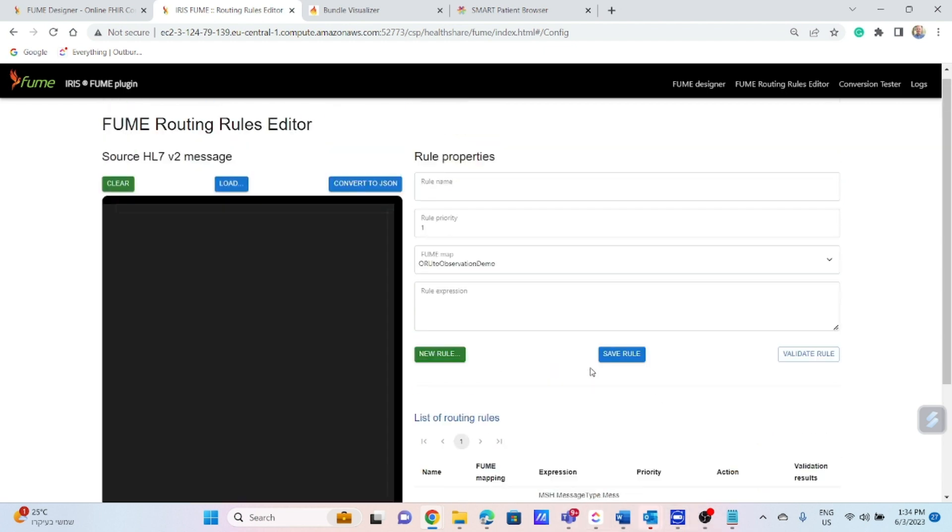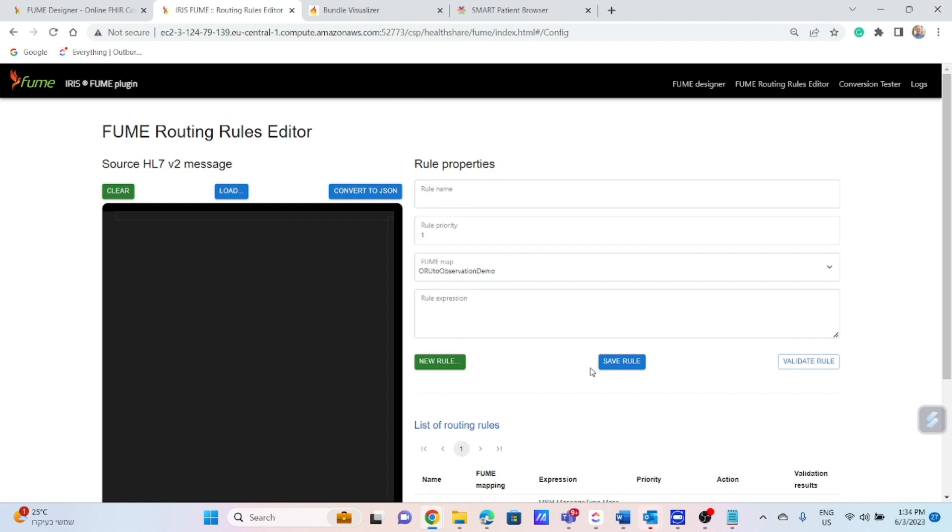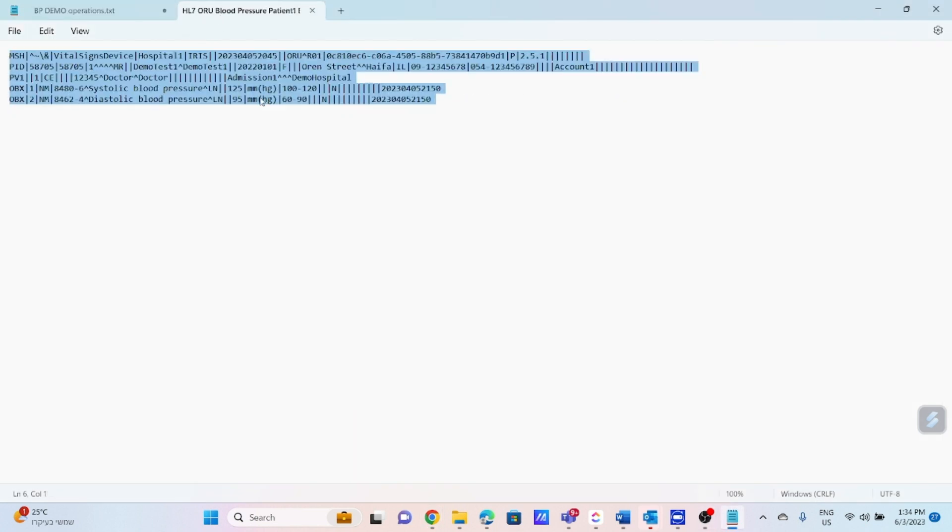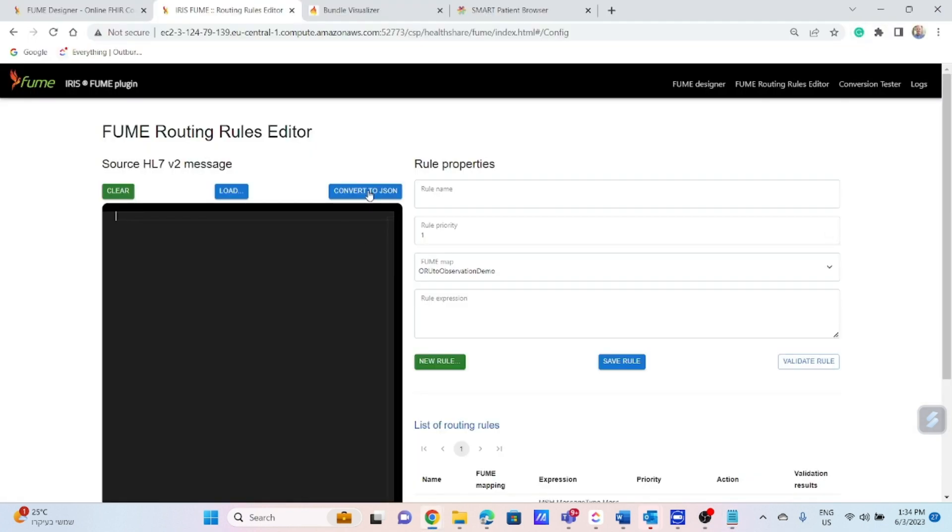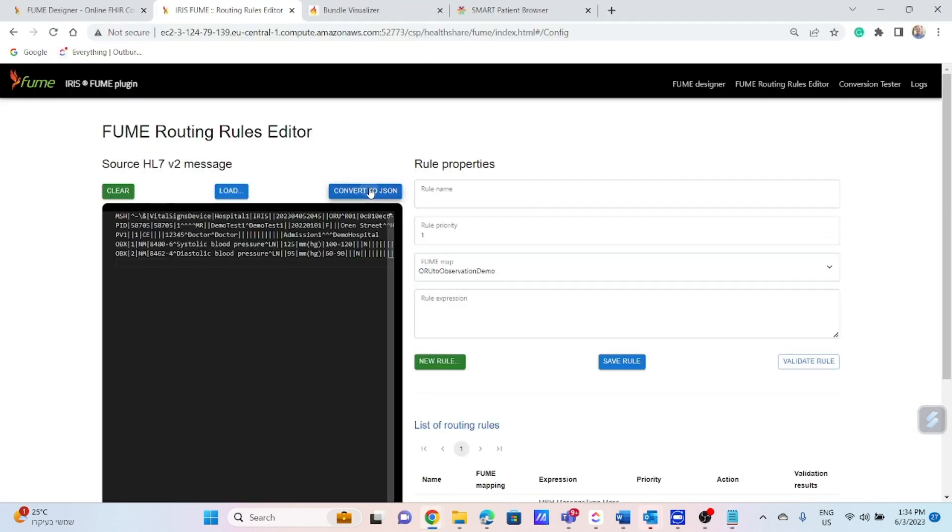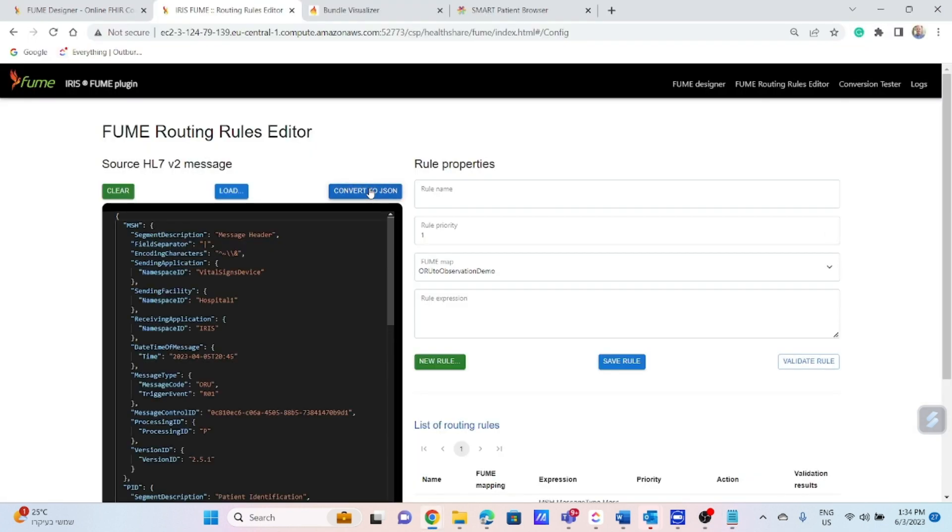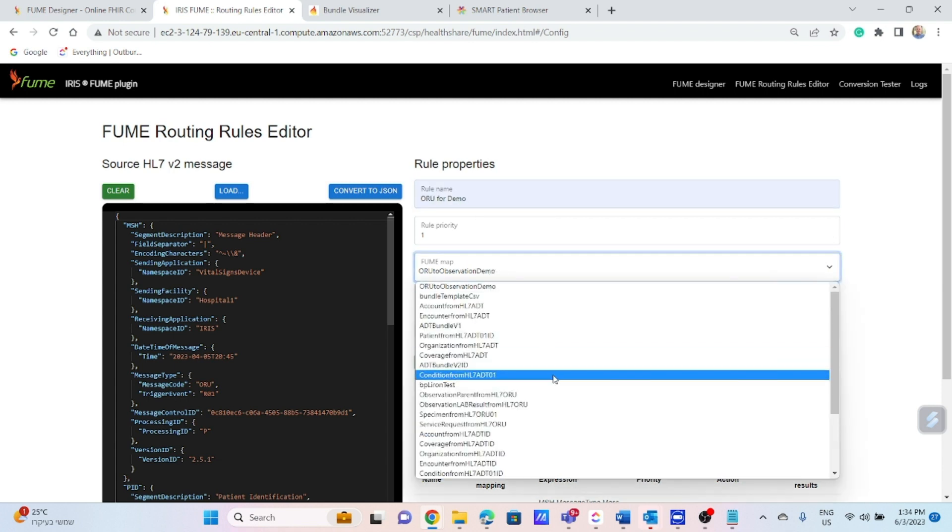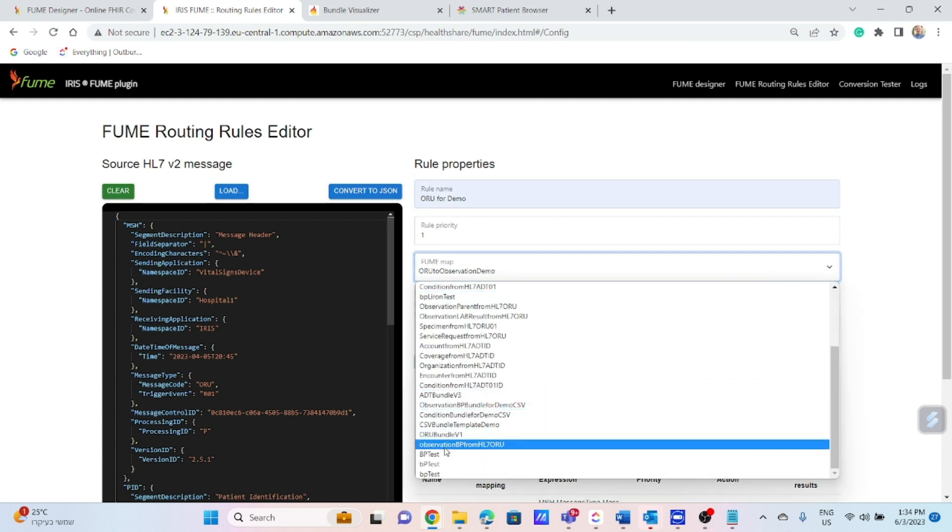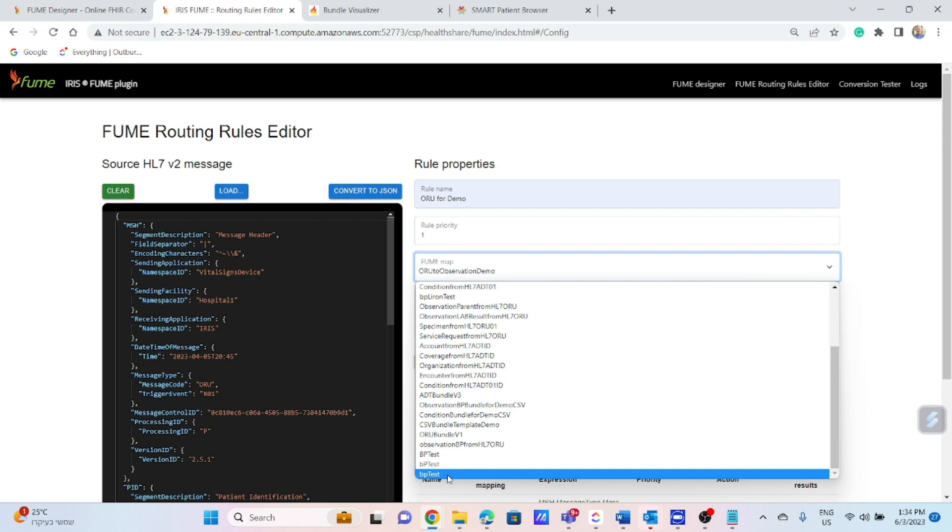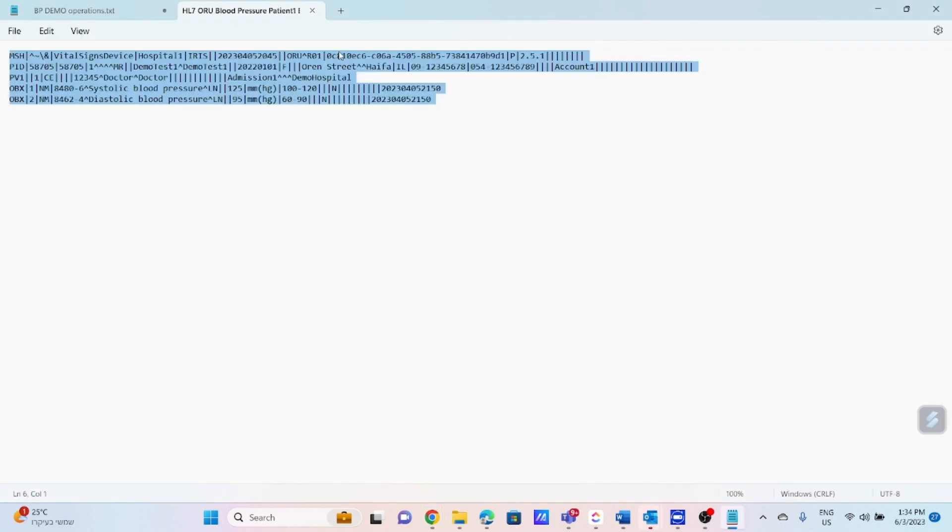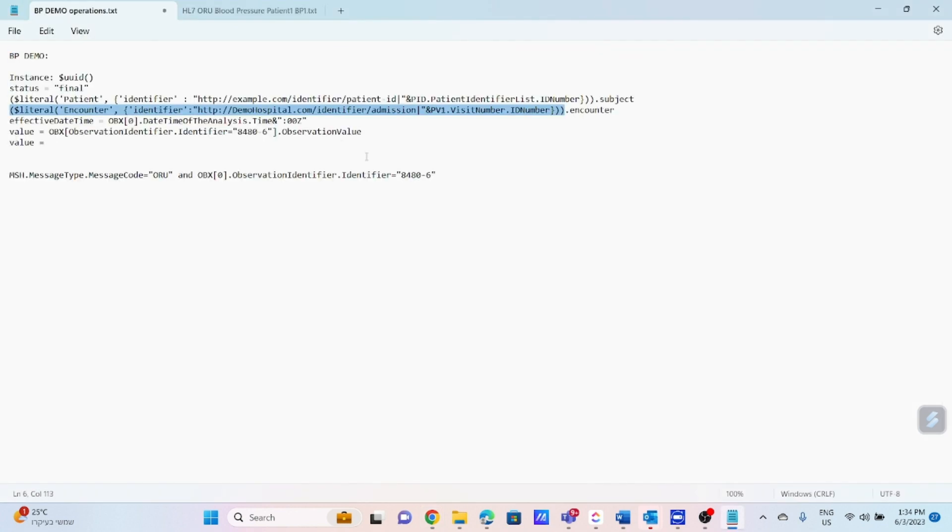Let's create the routing rules for the map we just created before. So I am taking the same source message, putting it here, and convert it to JSON. I have to assign a name for my rule. Then I have to choose the map previously created and saved, BP test, into the FUME map drop-down list and actually define the logical expression.